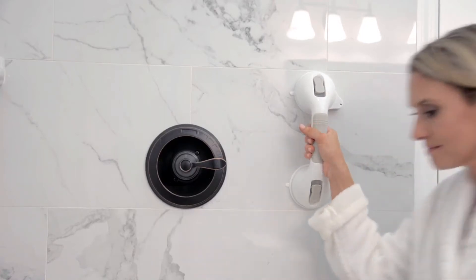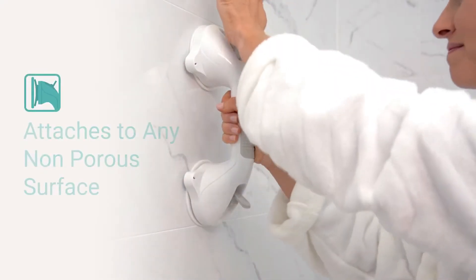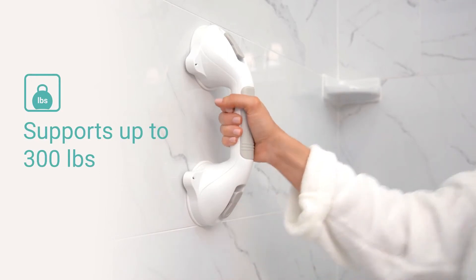The Suction Grab Bar by Vive provides safety and stability when entering or exiting your tub or shower. Strong suction cups attach to any flat, non-porous surface and support up to 300 pounds.